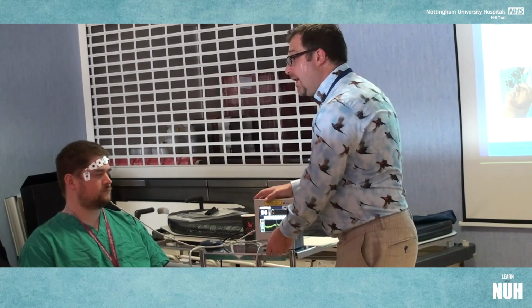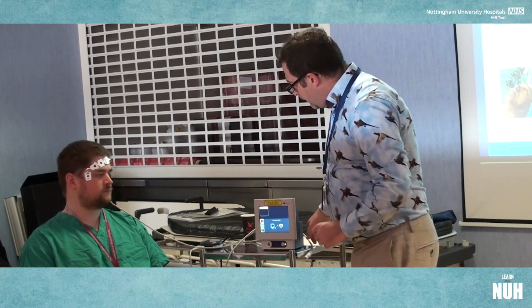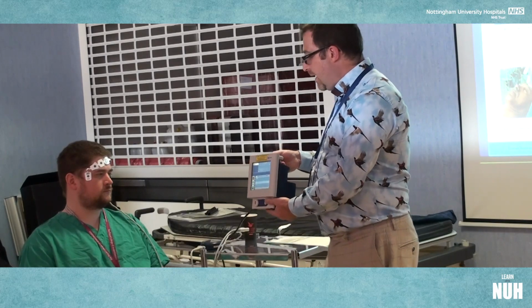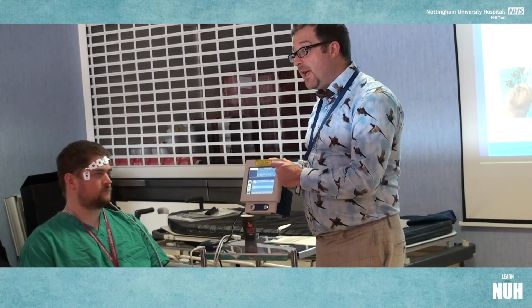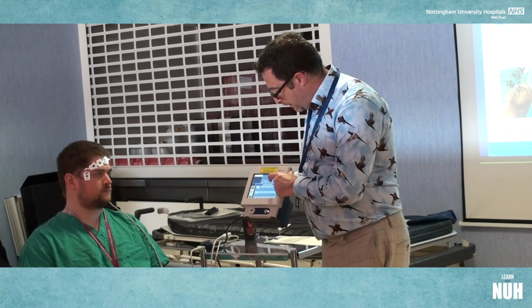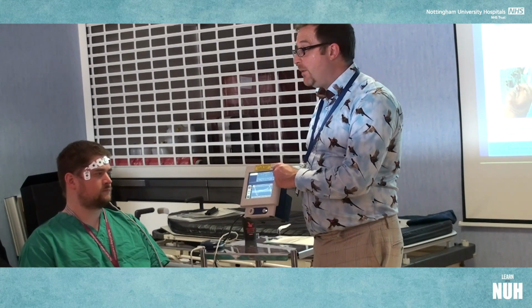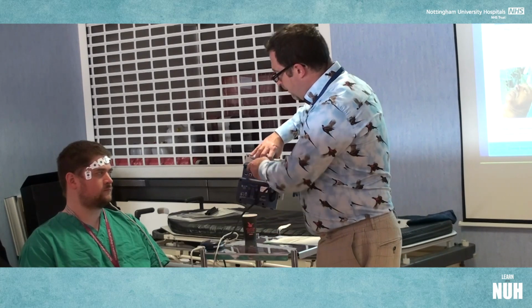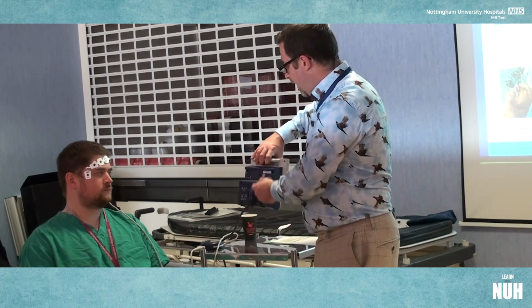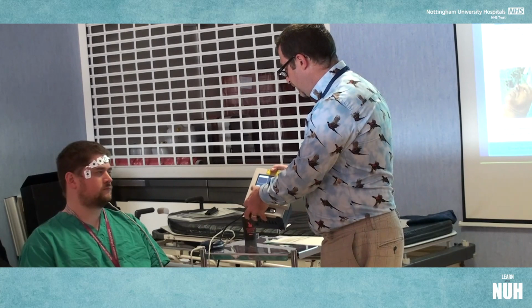And then when you're not connected to a patient, if we want to download the case, this bottom button becomes trend review. Okay, so what we can see here is the individual cases, the last 30 cases, but we can cycle through, and the top right hand button is a little download icon where we can download a PDF. So we just pop a little USB memory stick into the back and we can download any cases that we want to for teaching or to put in the patient notes. Okay, great stuff.